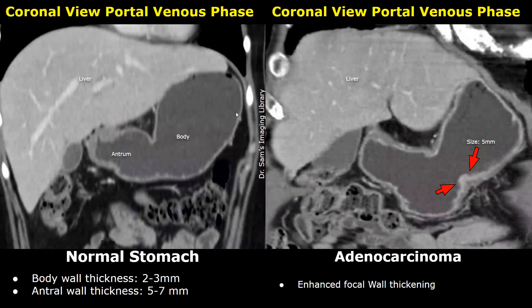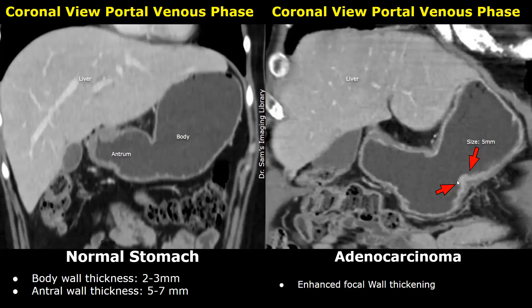This is a coronal image showing the stomach filled with water. The small projections are the rugal folds. The stomach wall at the antrum has increased thickness compared to the stomach wall in the body — the antral wall thickness is between 5 and 7 millimeters. In the image on the right there is an enhanced focal wall thickening that is somewhat irregular; this wall thickness was 5 millimeters and after biopsy it was found to be adenocarcinoma.